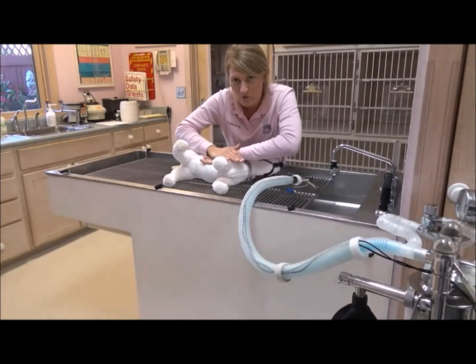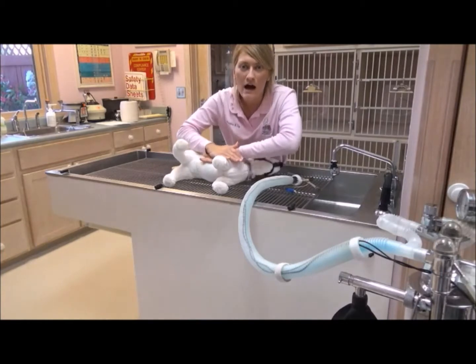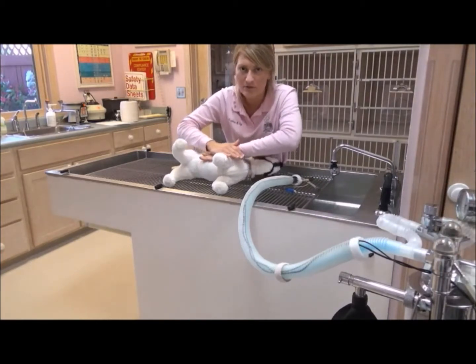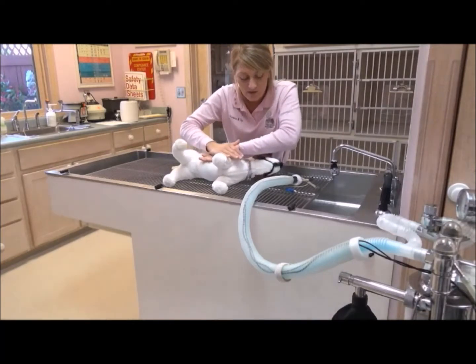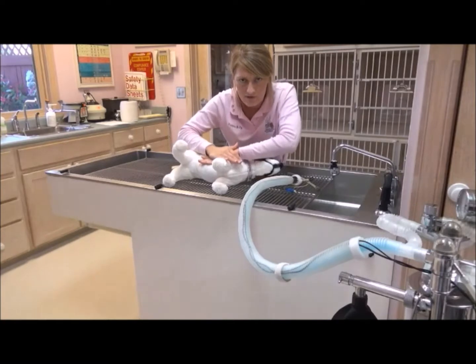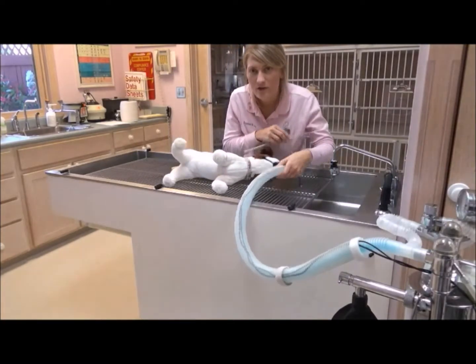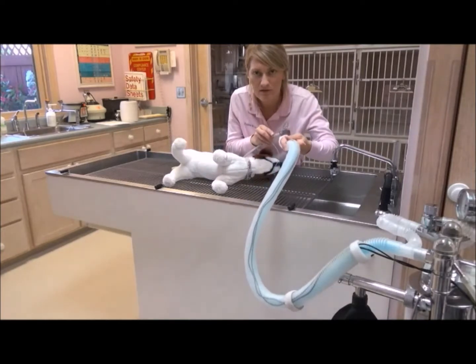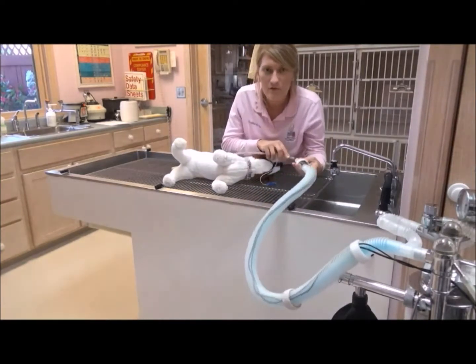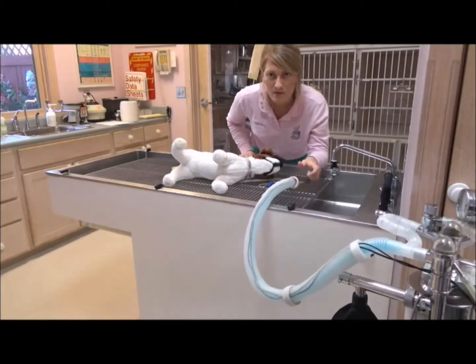At this time, while you're doing the compressions, it's ideal that you have a second person to help deliver the oxygen to the patient. So if your patient isn't intubated, you'll want to have that second person intubate them. And then once they're intubated, you'll connect them to the rebreathing circuit here, and they'll deliver 100% pure oxygen to the patient. So I'll show you that here.